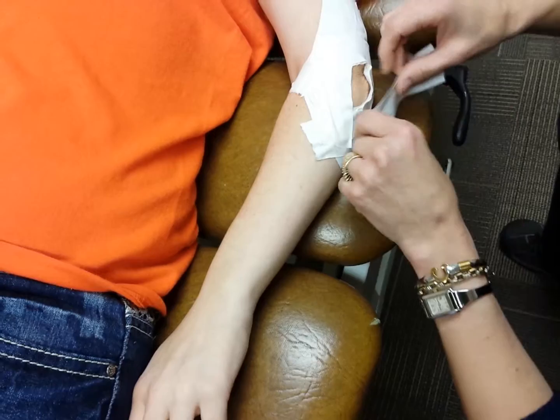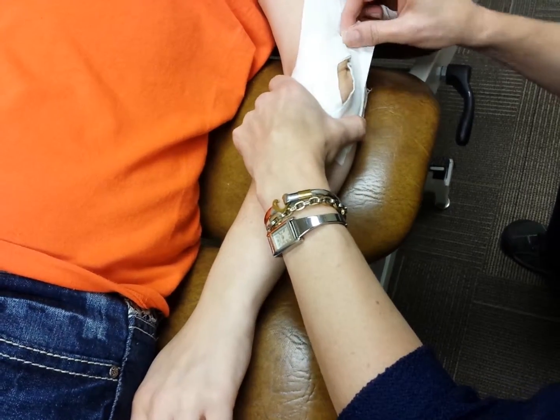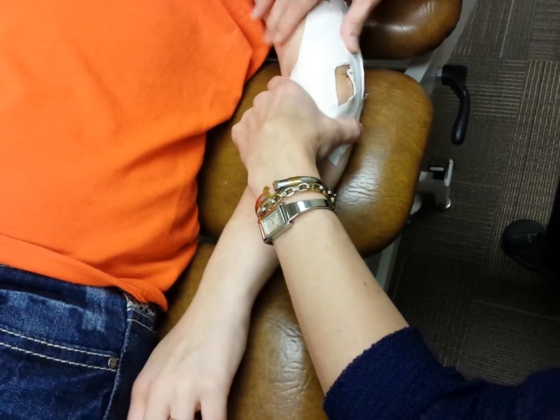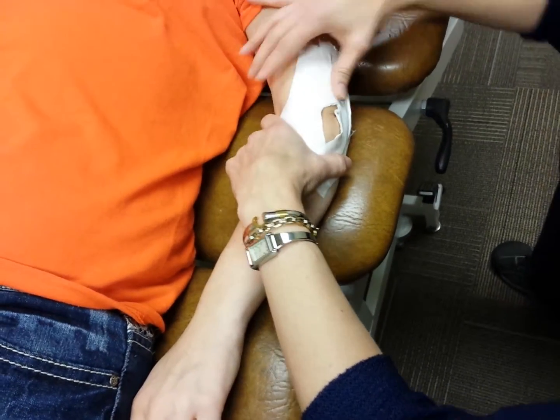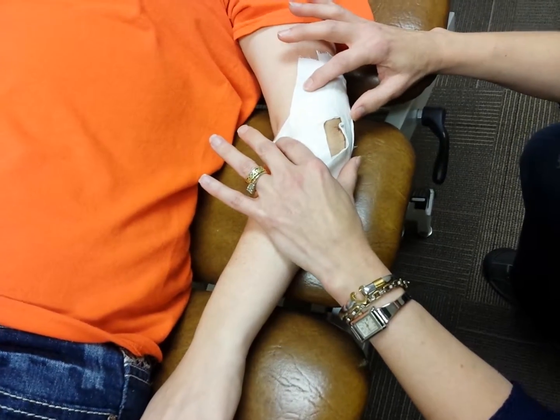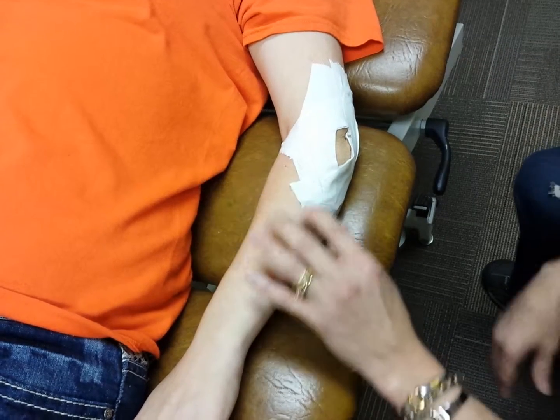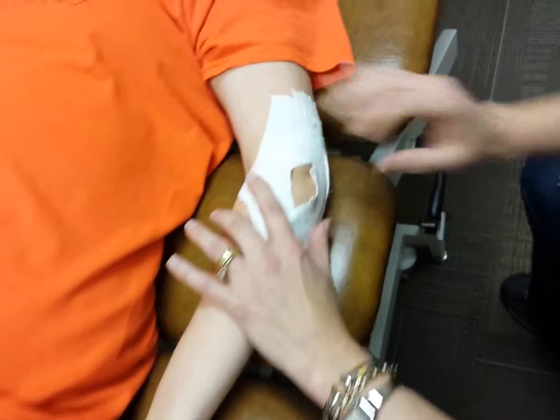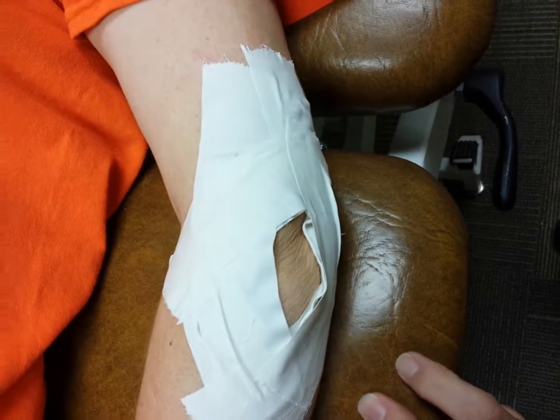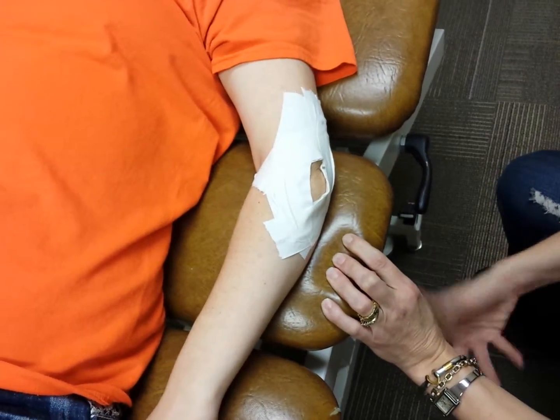Contraindications to this would be someone who has a pre-existing condition of dermatitis, if they're allergic to any adhesives, or if they have an open wound in the area. This is the diamond taping technique for lateral epicondylitis.